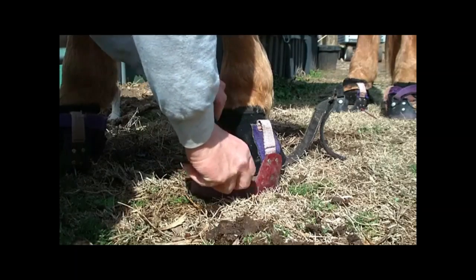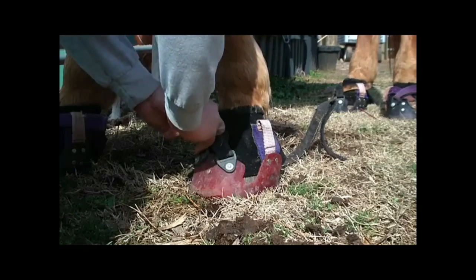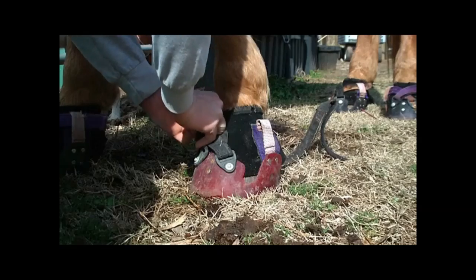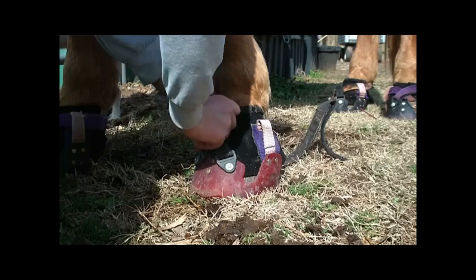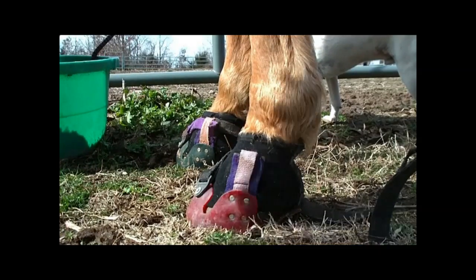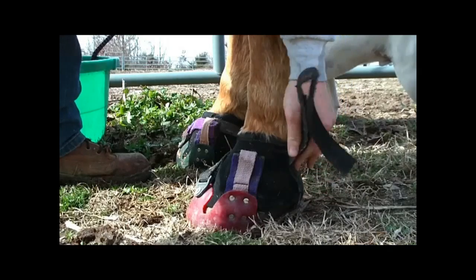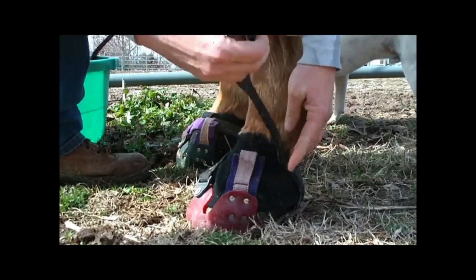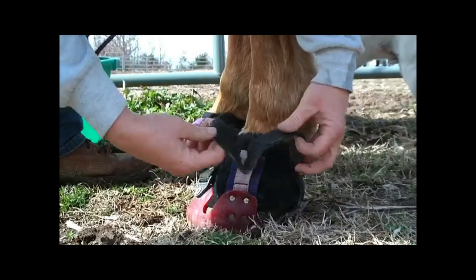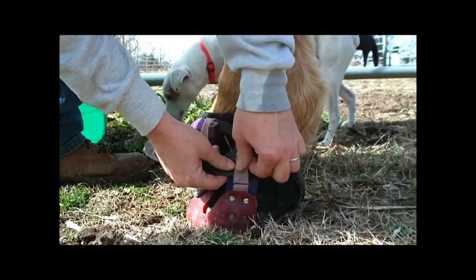Bring the strap through the plastic D — you can pull that forward with your thumb if you need to. Pull it a little tightly, then pass the strap underneath the side loop. Take the other strap up over the heel bulb — it will stay, you don't have to pull on it really hard. Pass the strap through the side loop.